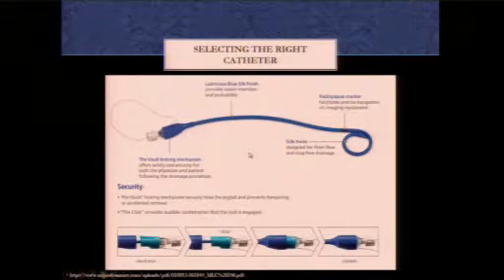So this just is another one. This is the AngioDynamics total abscession catheter, which we use here at HSC. And this just goes to show you it has the same features. There's a pigtail with side holes, radiopaque marker. The difference really is in the locking mechanism for the pigtail. So this will click into place when you've locked it.